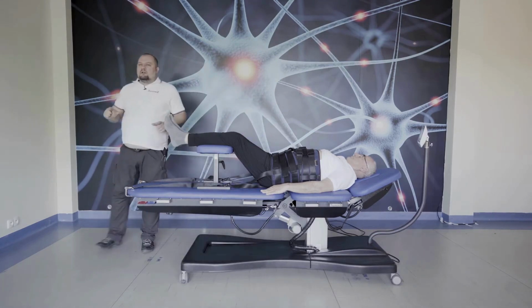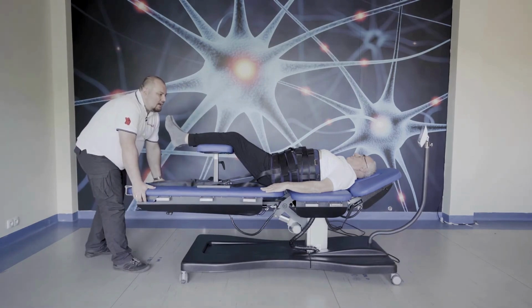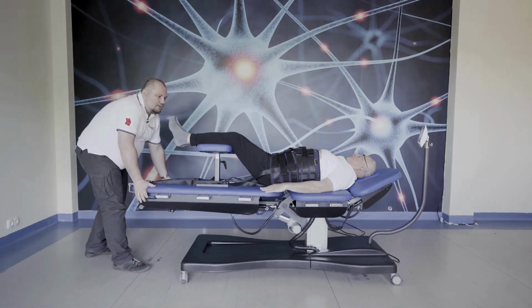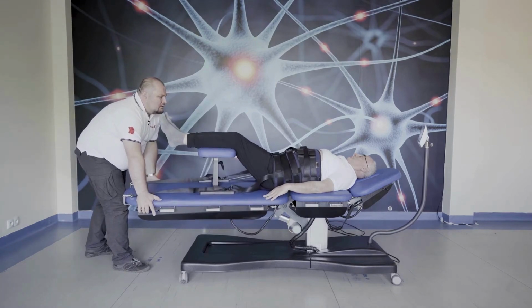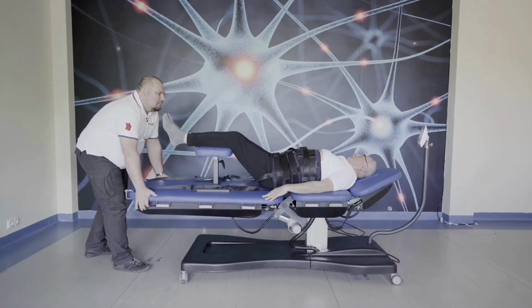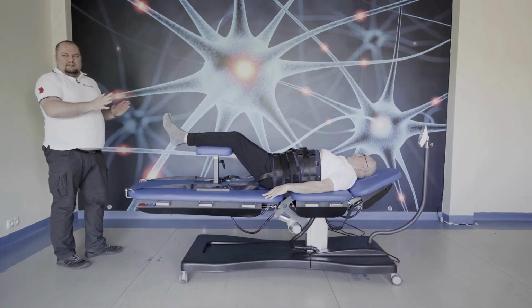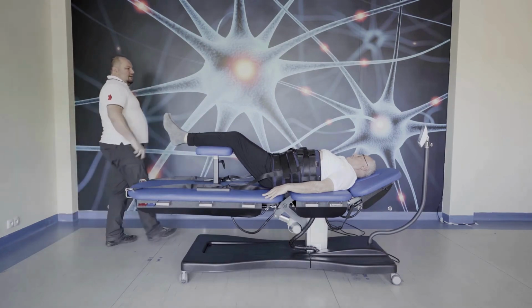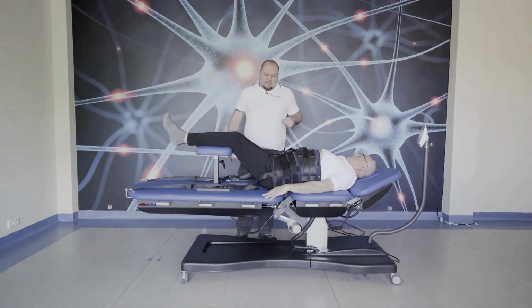If there is a problem with severe pain or scoliosis, we may adjust the patient position also in other planes, for side bending and rotation if needed. If not, the best position without severe pain is without side bending and rotation, and the spine in neutral lordosis or between lordosis and kyphosis.